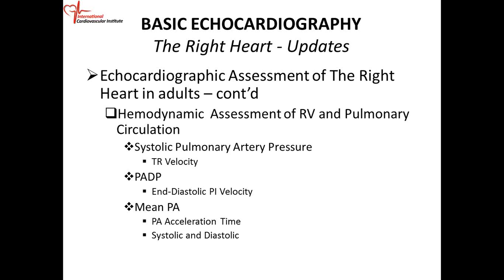The mean PA pressure now. Some of you who are doing studies, I know you have been doing your pulmonary artery acceleration time. But do you know why you do it? You do it because it enables you to get the mean PA pressure. The mean PA pressure is more meaningful than your pulmonary artery systolic pressure or your pulmonary artery diastolic pressure.